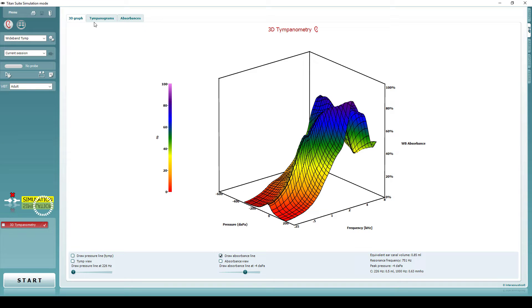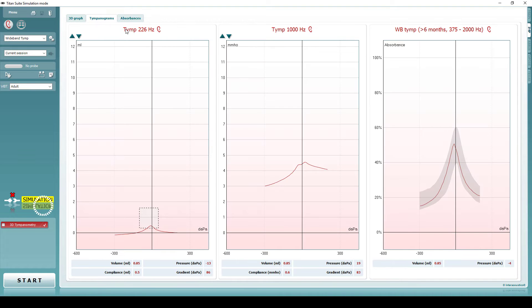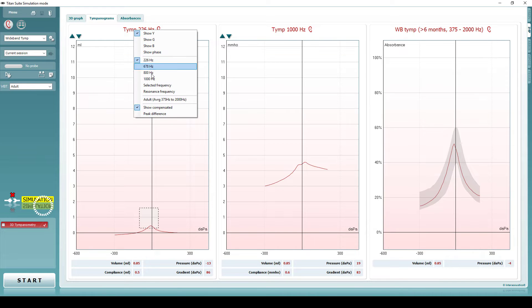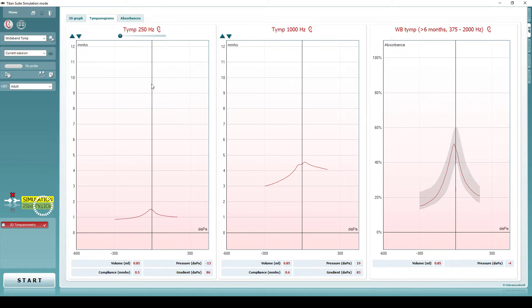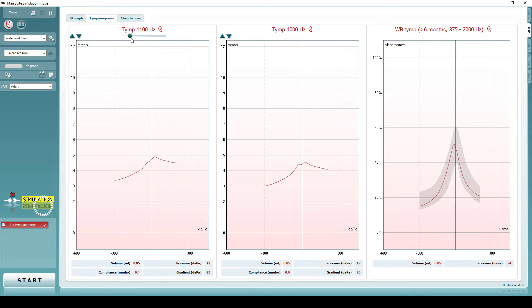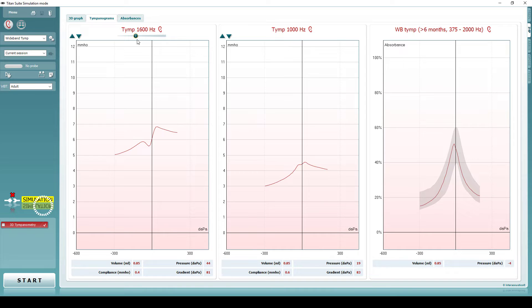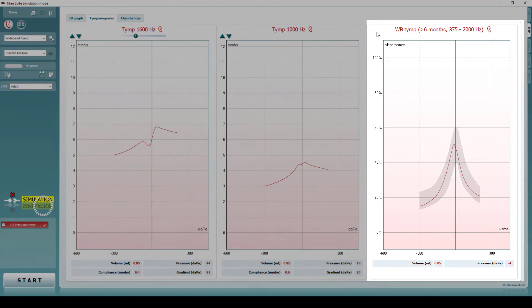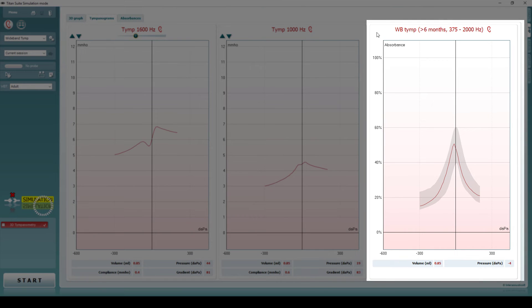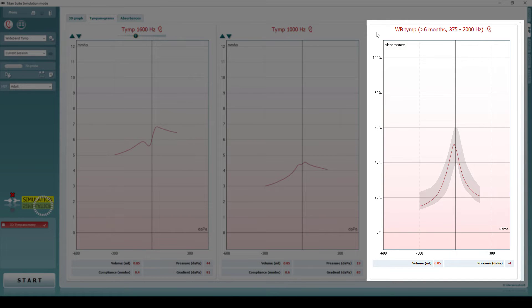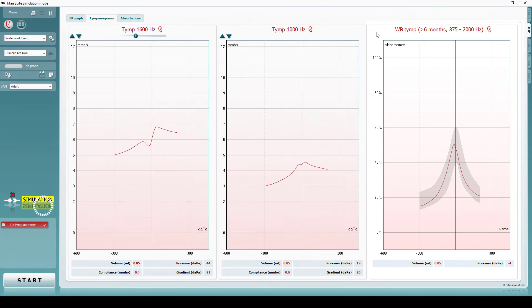In the Tympanograms tab, it is possible to select any number of the individual tympanograms. This is also where you can see the wideband average tympanogram, which displays an average of a range of the single probe tone tympanograms. This averaging process reduces unwanted noise and provides a clearer result for easier interpretation.